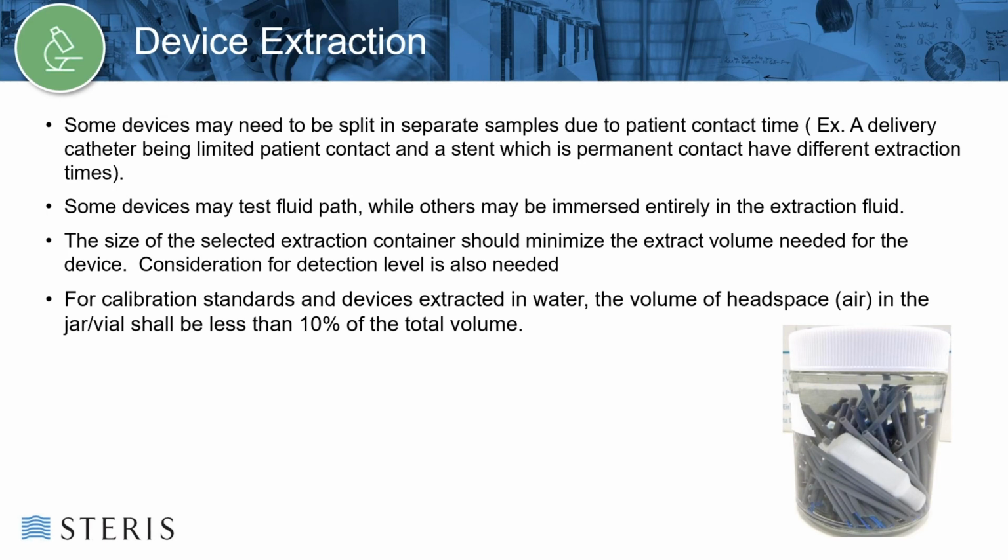Often multiple aeration time points are tested, as well as after both one full sterilization cycle, referred to as a 1X, and two sequential full sterilization cycles, 2X. 2X processing is performed to ensure reprocessing of a product sterilization run yields acceptable product residue levels.